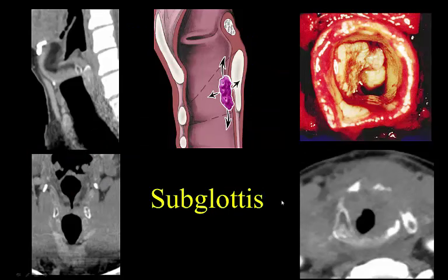Finally, the subglottis is formed by the signet ring cricoid cartilage. When you look at the subglottis, you look for the big O — the formation of the complete signet ring with no cricoarytenoid joint visible. On parasagittal images, here's the undersurface of the true vocal cord, the cricoid cartilage airway, and the shoulder-shaped appearance of the subglottis. This is a pathologic section and imaging example of a primary subglottic carcinoma. When you see the signet ring, you know you're at the subglottis.